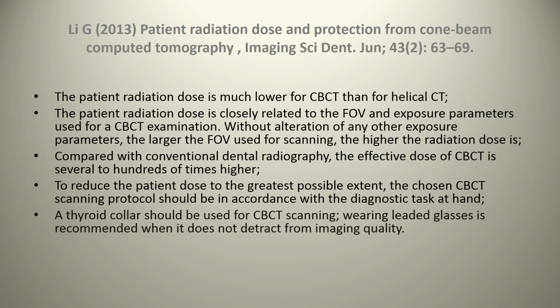So if you need to scan, say, a quadrant, you scan the quadrant. You don't scan the whole head. As well, they advocate that a thyroid collar should be used for CBCT scanning and that wearing leaded glasses is recommended when it does not detract from image quality.